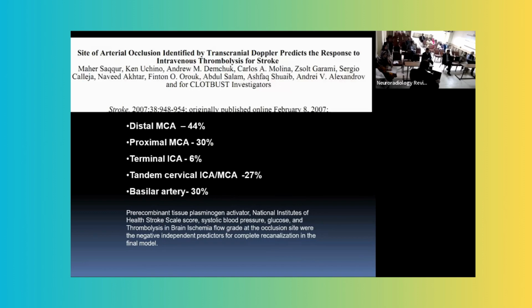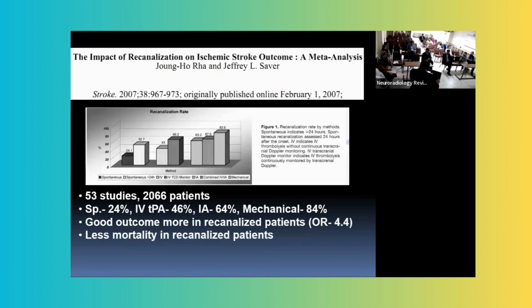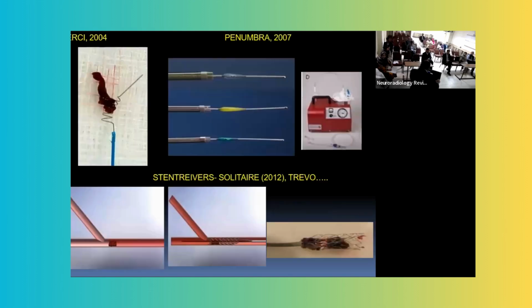So the famous DAWN trial has shown that mechanical thrombectomy has excellent results in the treatment of stroke. There are different devices. There are stent retrievers, there are aspiration catheters like Sophia Plus. Again, we place a 6-French sheath. We could use a navigation catheter. We can use a large navigation catheter like Sophia Plus.